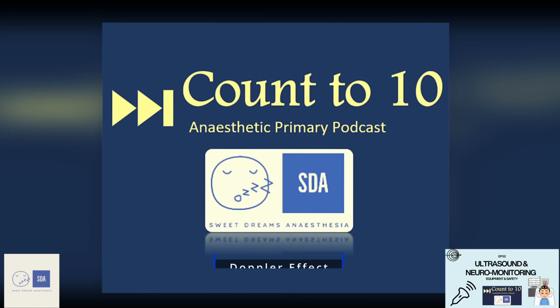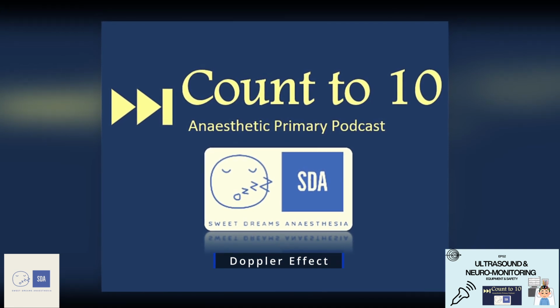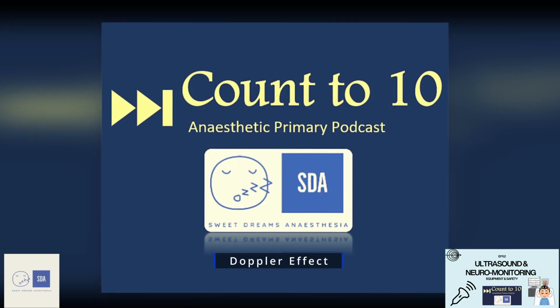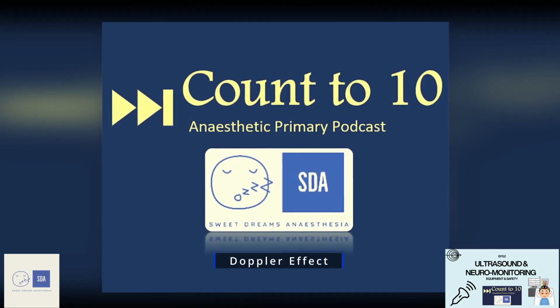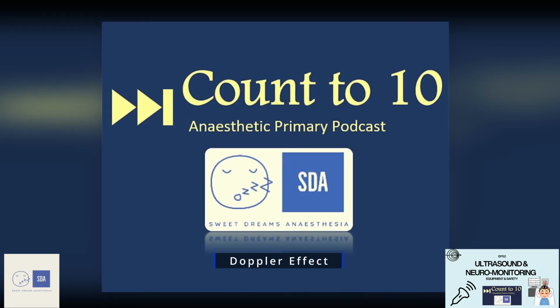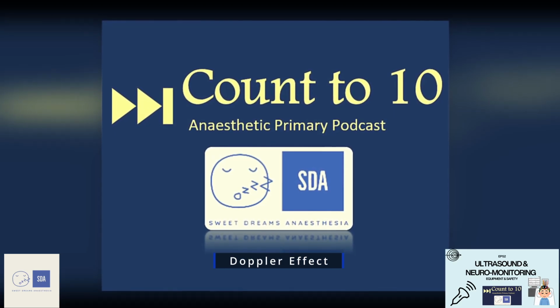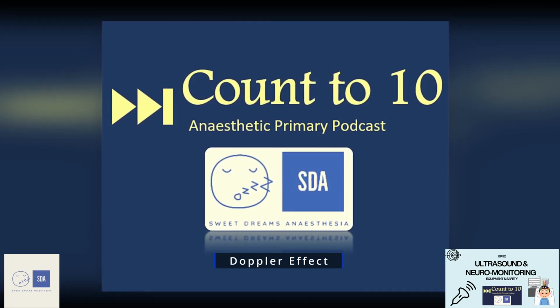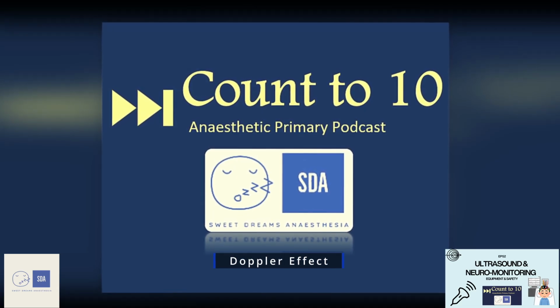This then moves us on to look at the second learning objective for today, which is to describe the physics of ultrasound imaging and the use of Doppler. Doppler is a mode of ultrasound imaging, just like B mode, which we spoke about, which used time and strength of the reflection to generate an image. Another mode you might see on your ultrasound machine is M mode. And briefly, M mode captures the movement of a tissue across a single scan line.